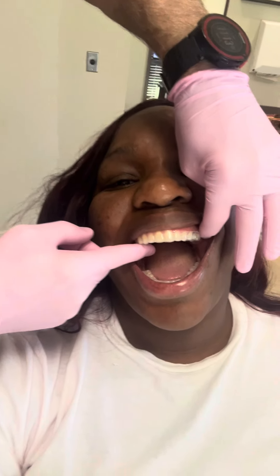How do they feel? Make sure they don't put any pressure on your gum. Okay, so let's check these retainers here — open kind of big. Very well crafted retainers, fit like a glove, and your smile looks gorgeous. Thank you. Are you going to send her home with these models?